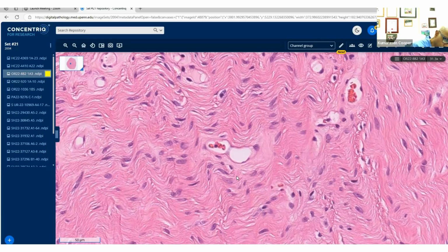So we've talked about two tumors that have RB1 loss today. We've talked about the myofibroblastoma. We mentioned that in the differential. This would certainly be a differential in this case as well, because the myofibroblastoma falls in that location. And remember, myofibroblastoma of the breast was first described in men, really. So then extramammary myofibroblastomas, and then of course following that milk line all the way down to the lower genital tract and the buttock as well. I've seen them in the buttock, so they can occur there.